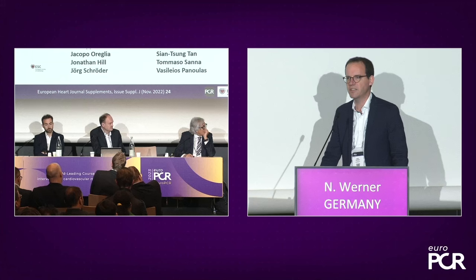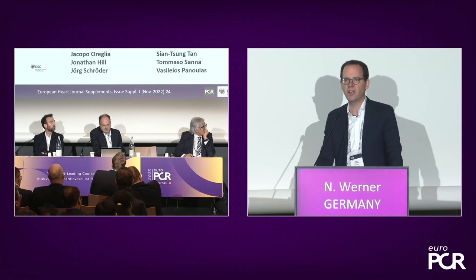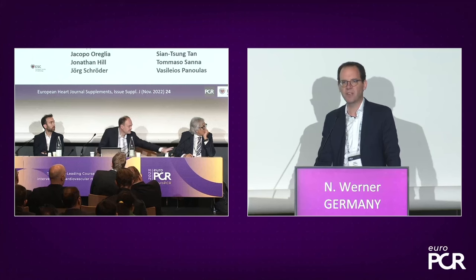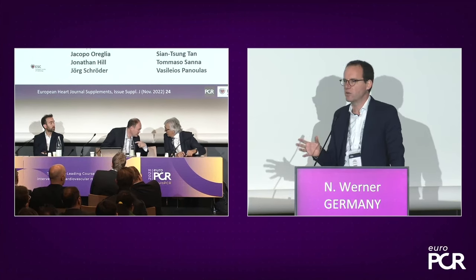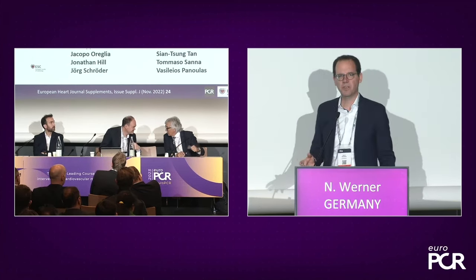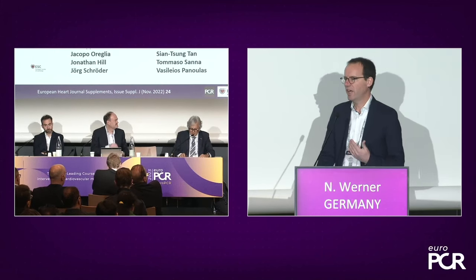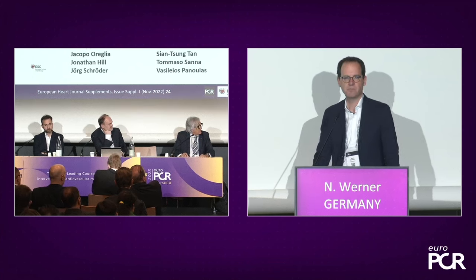We strongly suggest to do that during these procedures. You can nicely monitor, of course, all other hemodynamic parameters. And when you come up after maybe 10, 15 minutes, that's the normal time for us, with a favorable hemodynamic, we take it out. If there's any doubt, we go for another 2 hours.